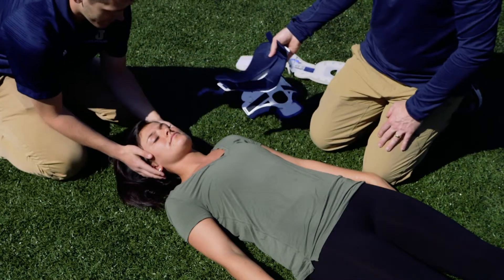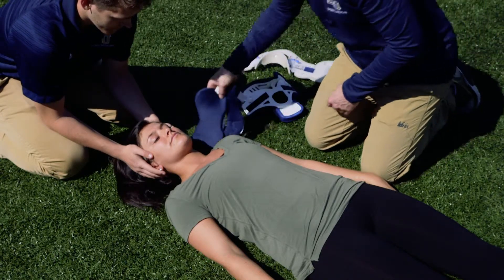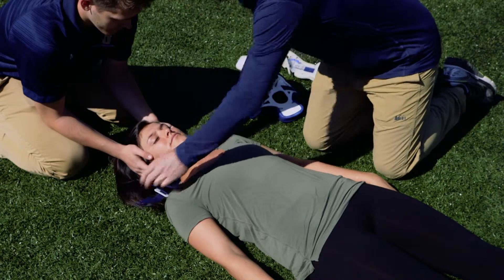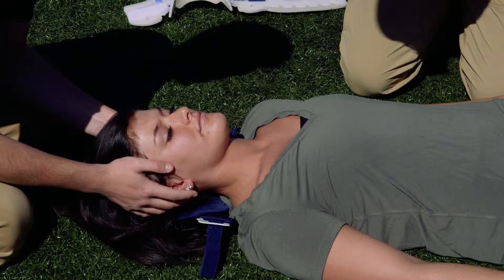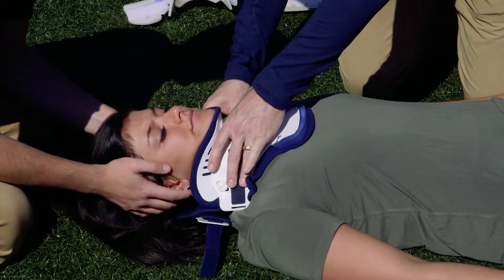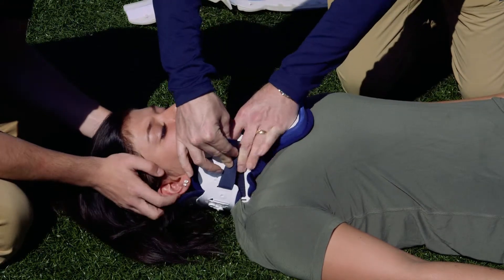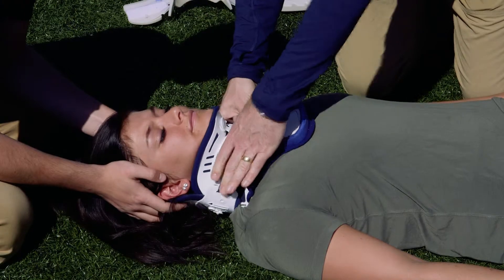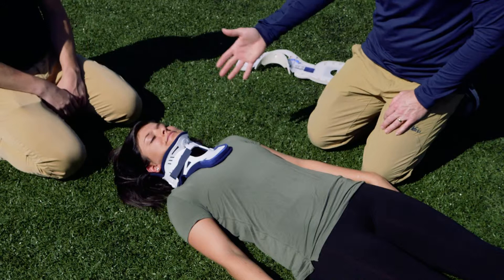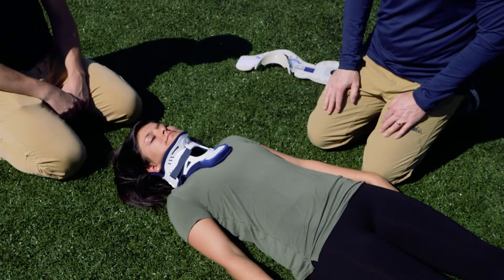Our assistant is doing inline stabilization, making sure the athlete doesn't move anywhere. I'm going to slide the C-collar directly up underneath the neck, making sure it's equal distance on either side. Then I'll bring the front piece in and slide it directly underneath the jaw. I'll Velcro strap the pieces in, making sure it's nice and secure, and now we can transport this athlete onto a spine board or stretcher.